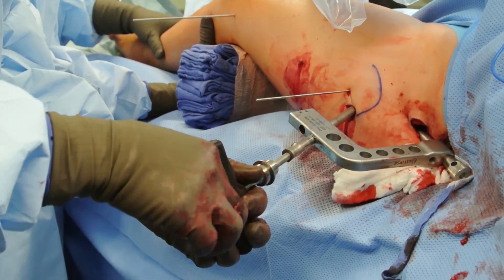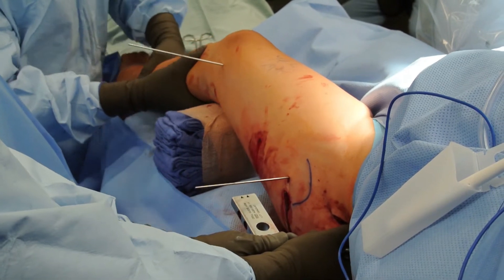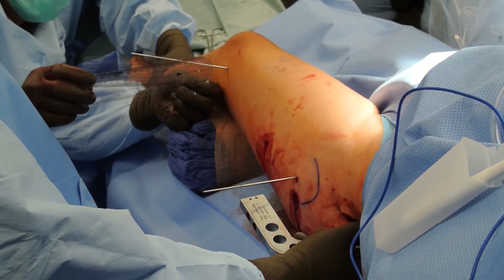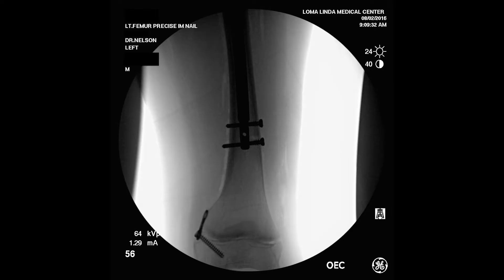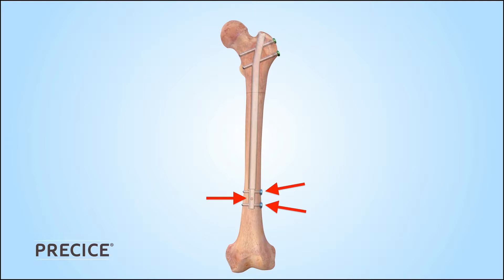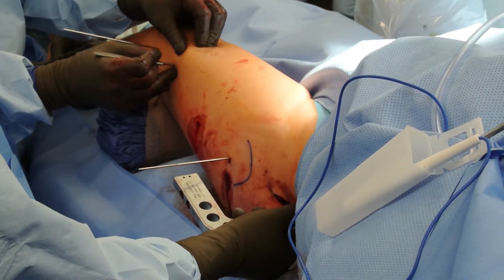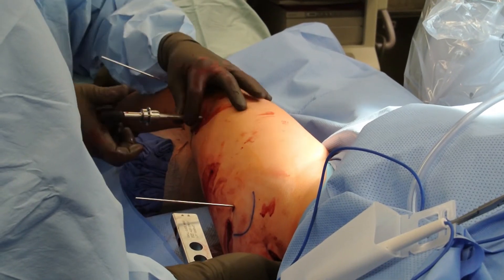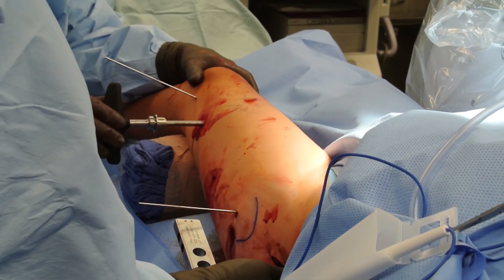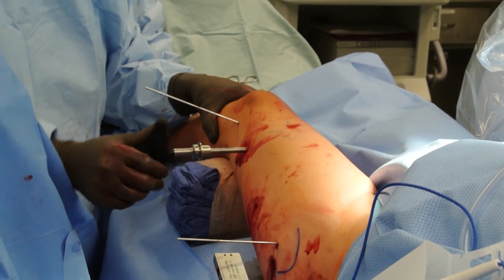It is important to note that these interlock pegs have an inner thread in the screw head which should be attached to the screwdriver for ease of placement. In this case, we desired to internally rotate the femur by 15 degrees, and this is assessed using the rotational guide pins and a sterile goniometer. The surgical assistant then maintains this position while freehand technique using perfect circles with fluoroscopic guidance is used to place the distal interlock pegs. Although it is possible to place three distal interlocks in this nail, it is usually only necessary to use two. Typically, these two are placed lateral to medial through a single incision. It is important to round up the length needed for the interlock pegs to provide maximal fixation. Sometimes gentle pressure needs to be applied to initiate the screw threads into the lateral cortex. The peg should slide into the bone and across the interlock hole and then only require a minimal number of turns before it is fully seated.